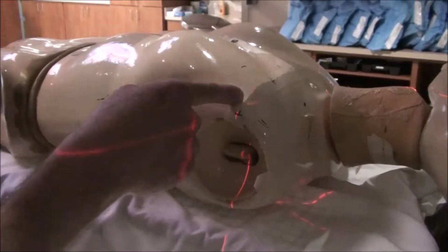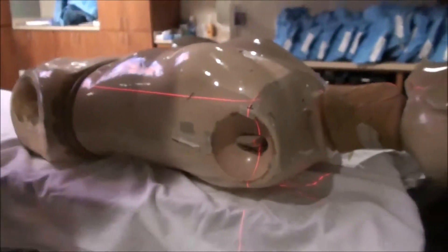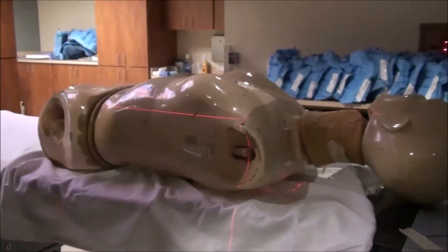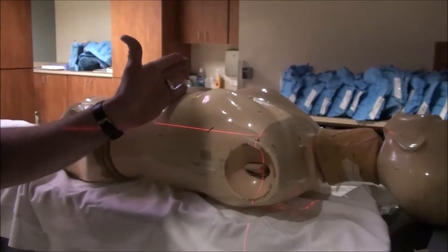There's our match line — it's naturally non-divergent. You don't have to kick the table, you don't have to move your patient, you don't have to do anything. You have that same flat knife edge, butted up against itself.